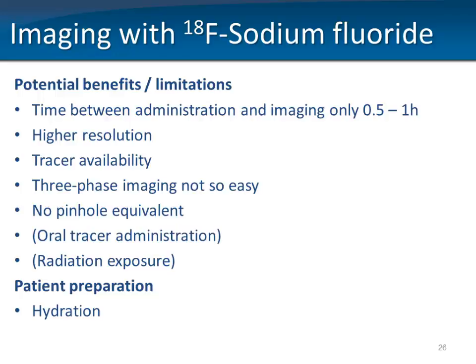So unfortunately, 3-phase imaging is not so easy to do on PET-CT. We don't really have a pinhole equivalent. On the other hand, you can use oral tracer administration in children if vascular access would be an issue. You have to consider radiation exposure, even though that is somewhat relative. I will come back to that later. And likewise, the only patient preparation that is necessary is hydration.